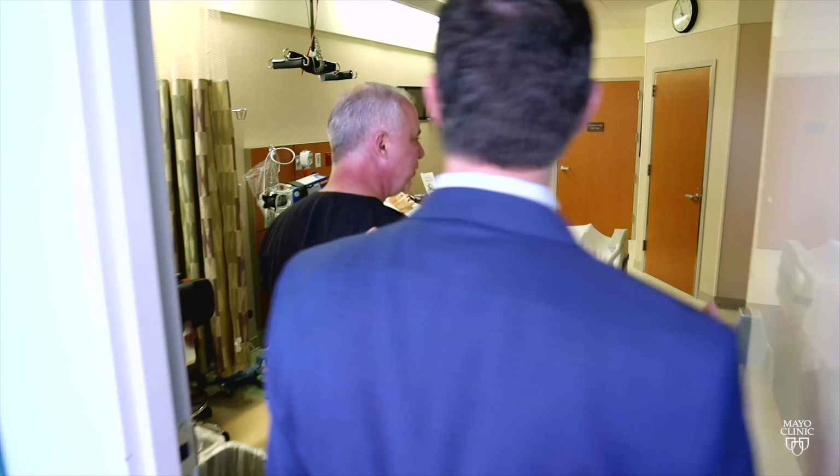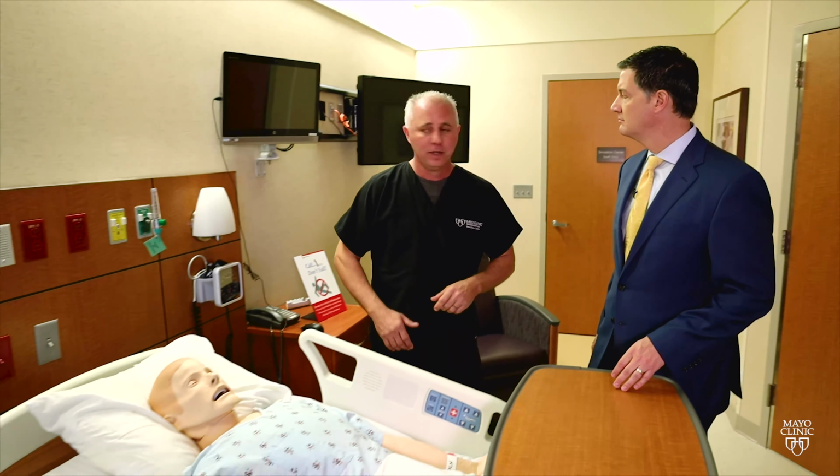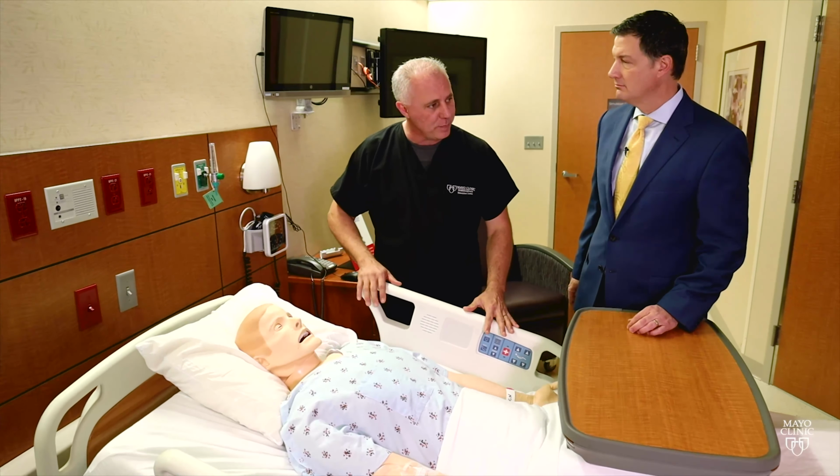So it says patient room 1. Conrad, tell me about this. So this is one of our standard patient rooms, and this is an exact copy of what one of the hospital rooms looks like across the street. So when people come in to train, they train on the exact head wall, the exact bed. The countertops are the same. All this is important because they train in the situation of exactly how they would across the street.